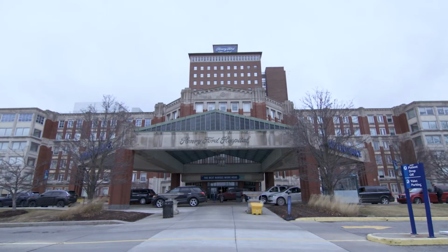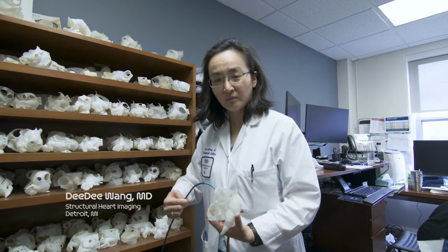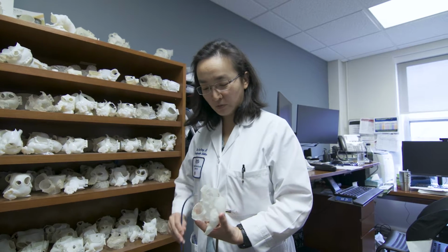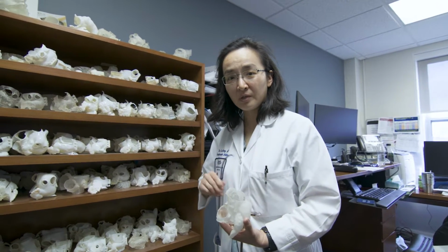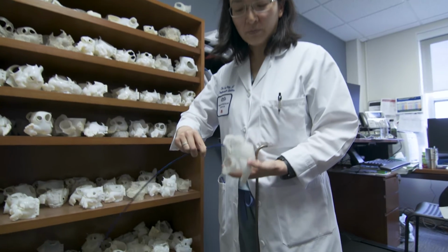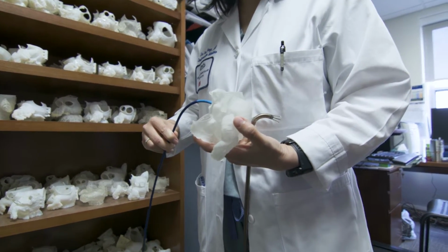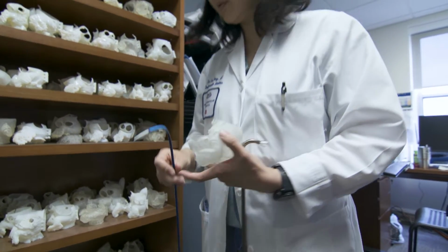Every time a catheter goes into a patient's heart is basically a chance for a stroke to occur. It requires extra radiation exposure because we put in a wire and we have to see the catheter go into the patient's body. And it also requires additional procedure time. So if I can bench this, and I just did that on two different patients in less than two minutes with a 3D model and this heart, I've just saved at least 10 to 15 minutes of procedure time and a stroke risk in the procedure, and made it safer for a patient already.